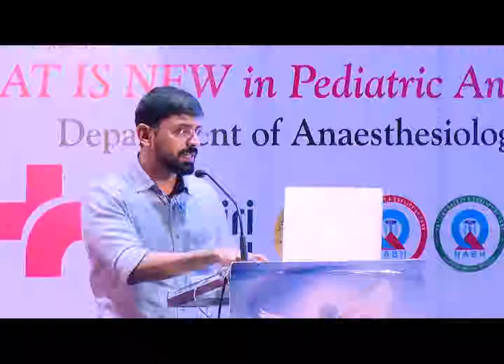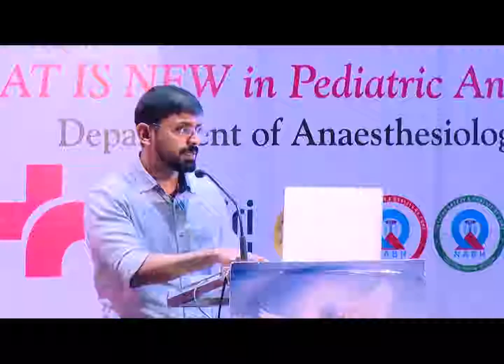In SIPPV, that problem is mitigated to a greater extent, and you can see that the tidal volume being delivered is fairly more uniform. That is because each and every breath that happens is supported by the ventilator. These three graphs also show the erratic pattern of flow that happens in intermittent mandatory ventilation. That chaotic pattern is mitigated to a small extent in SIMV, but it is solved to a greater extent in SIPPV, which is why SIPPV ventilation has a lot more benefits in the newborn.